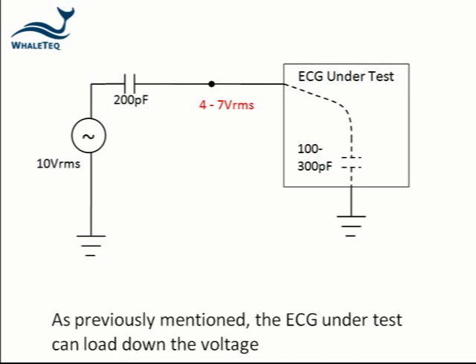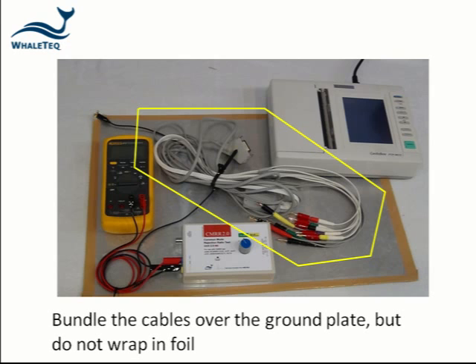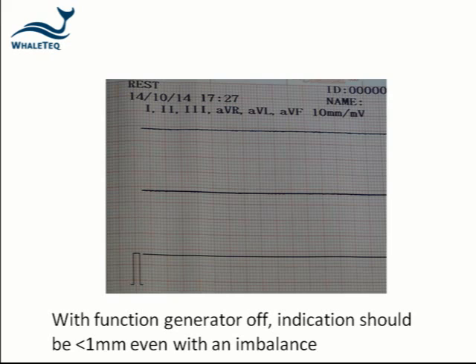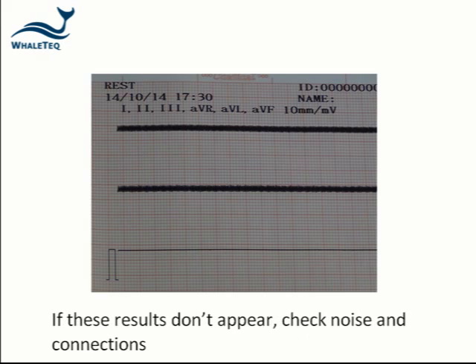As previously mentioned, the ECG can load down the voltage. This includes the stray capacitance from the cables. It is recommended to bundle the cable over the ground plate, but not to wrap it tightly in aluminium foil. After setting up, always check for expected test results. With the function generator off, we expect to see less than 1 mm on the ECG record, even in the imbalance condition. With the function generator on, we expect to see 2 to 7 mm on the ECG record in the leads affected by the lead electrode that has the imbalance. If these results don't appear, check for noise and connections.